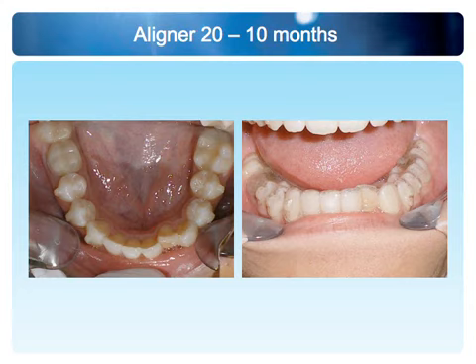And here is the aligner number 20 showing the fit. It's a little bit off, but we're not too concerned. You know, we're bringing this tooth from a very poor position to an excellent position, and we always have refinement to do a little bit more work if we like.